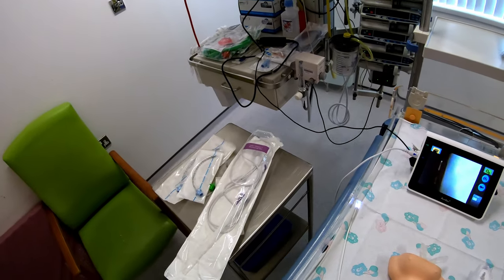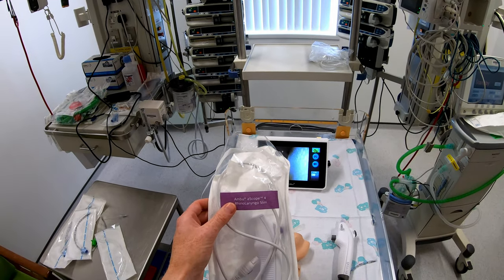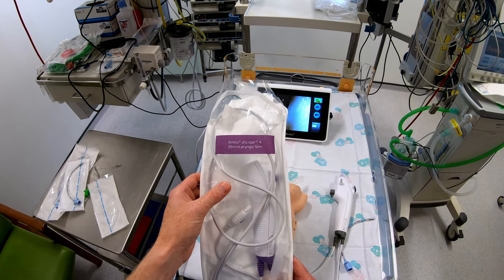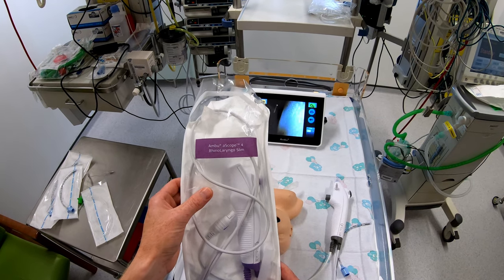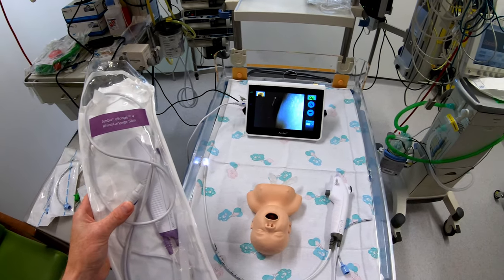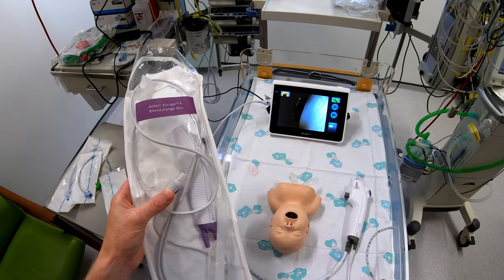So when I did hear that Ambu had released a new product — although it was designed mainly for the ENT market — this slim version of their ENT scope will actually fit down a size three and a half tube. So I was really keen to see whether I could use this for intubation. I've got a neonatal model which I'm going to try and intubate with this three and a half internal diameter tube, and we'll see how we get on.